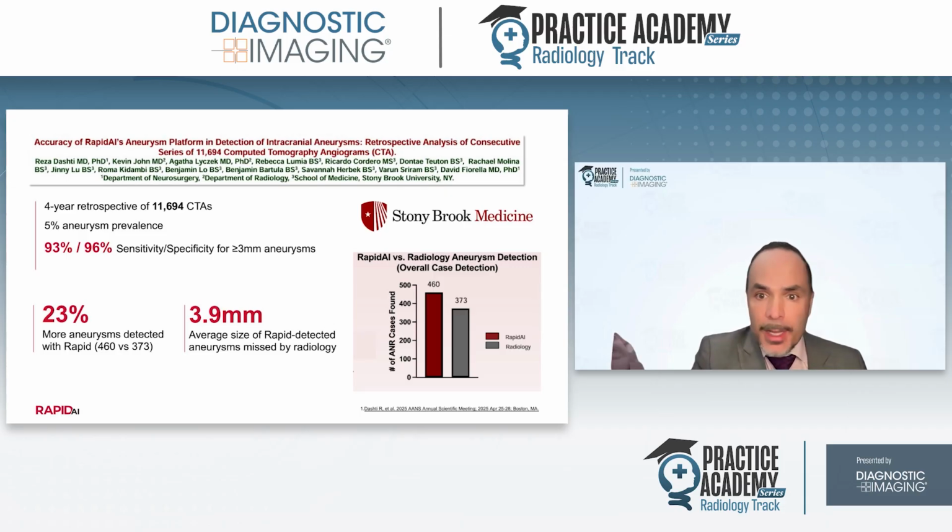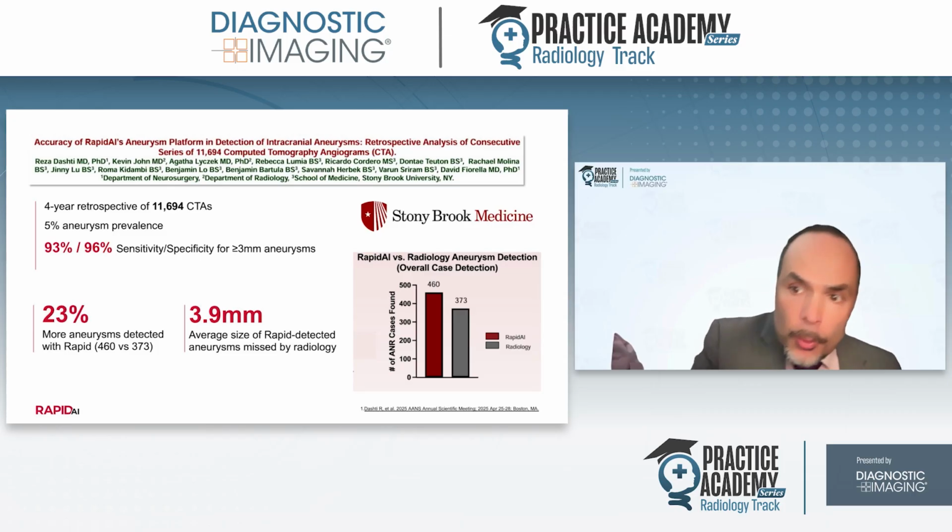And the first question that comes to mind is its sensitivity for small aneurysms. They did show high accuracy in detecting aneurysms down to 3 millimeters. So really setting a new leading bar for the detection of aneurysms in a really impressive benchmark. Now, they also showed that Rapid was beneficial in identifying 23% more aneurysms.